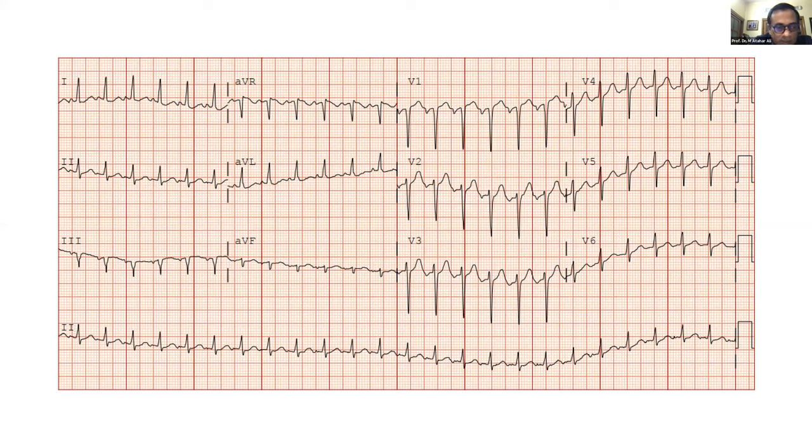Vishal, yes, please. So, here is a patient with a 12-lead ECG with rhythm lead strip, probably taken at standard speed and voltage, showing a narrow QRS complex, regular tachycardia at a rate of around 150 beats per minute. We can see the P wave is inverted in lead 3, upright in lead 2, biphasic in V1, and upright in aVR. So it might be coming from near the sinus node. And if the rate is 150, I would like to consider other tachycardias besides just sinus tachycardia. Okay, so your primary diagnosis is sinus tachycardia, right? Yes, sir, my primary diagnosis.